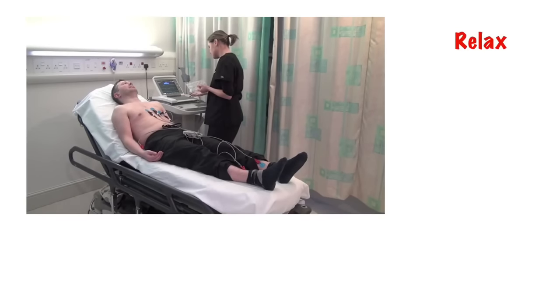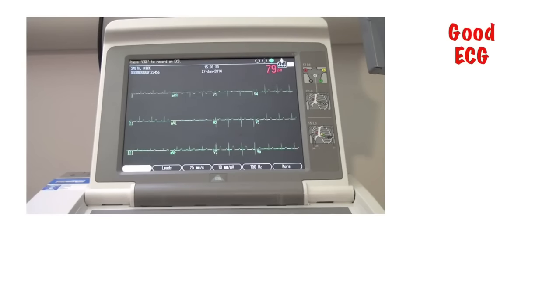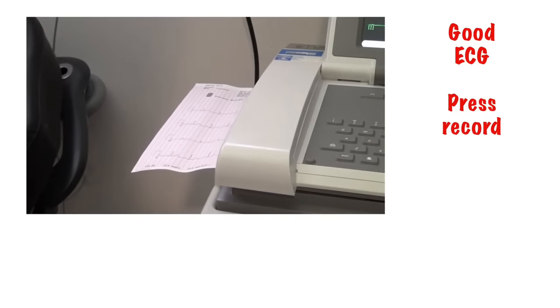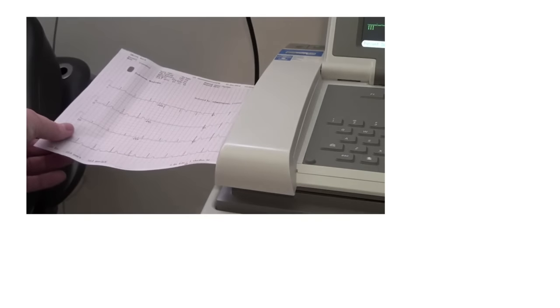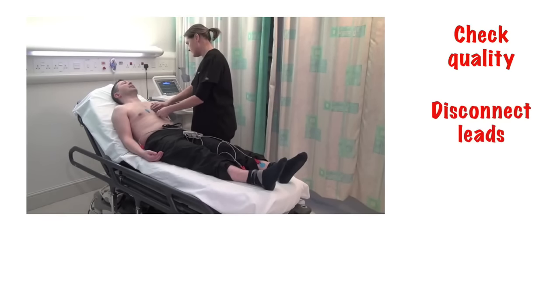Ask the patient to relax and breathe normally and not to move around. Check that you have a clear recording on the screen for all your leads and then press the ECG record button. All machines will vary a little so make sure you're familiar with the one you're using. Check the quality of the printout and then, if you're happy, disconnect the leads from the patient. If you're not happy, then repeat the recording until you are.